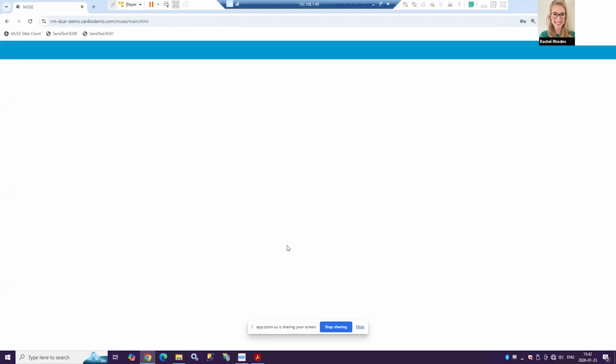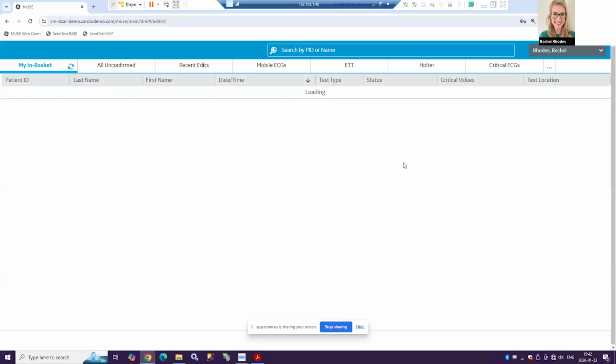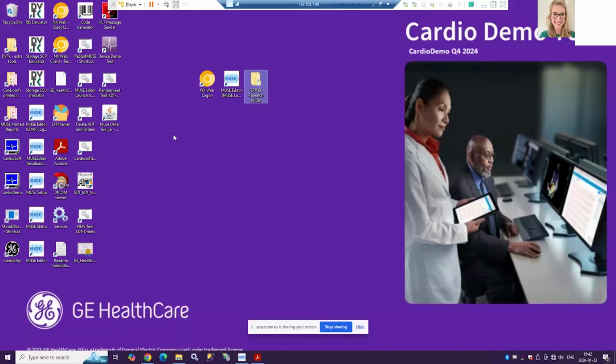Oh, that's a good one. I'm not sure. On my demo tool I'm a little bit limited, but it's certainly something we can try and find out. Sophia, I don't know if you know the answer to that one. I don't know by heart. I would need to try as well. So we may need to come back to you on that.